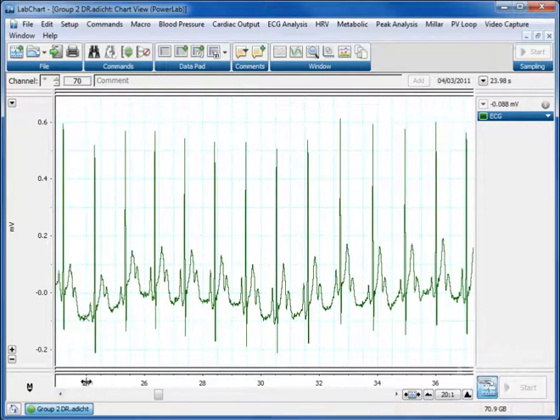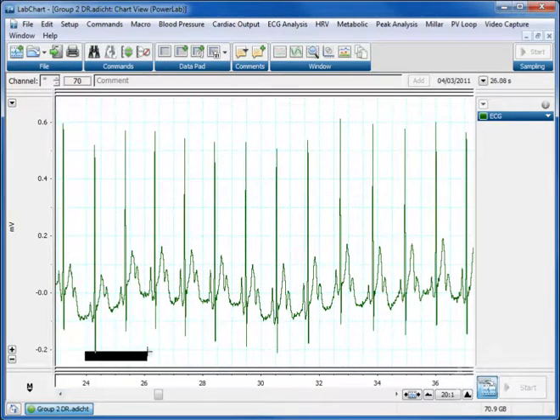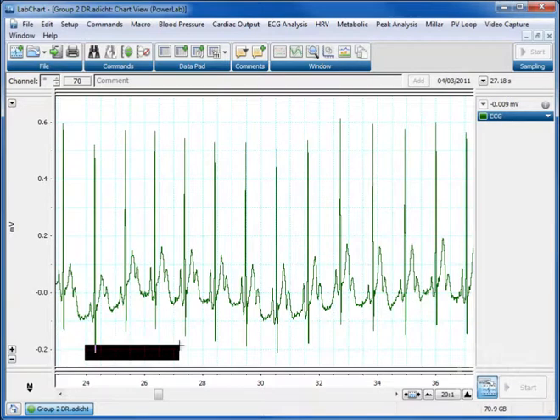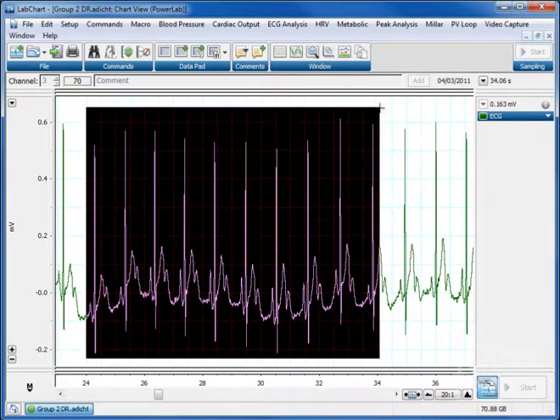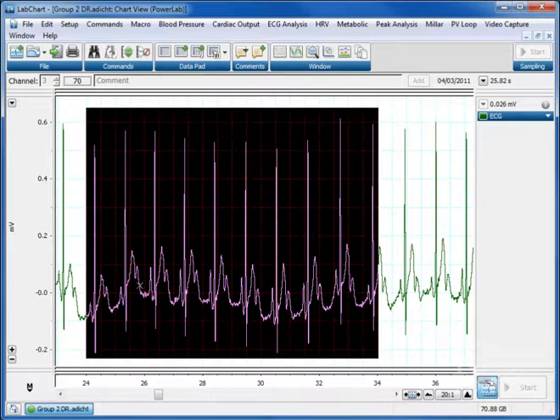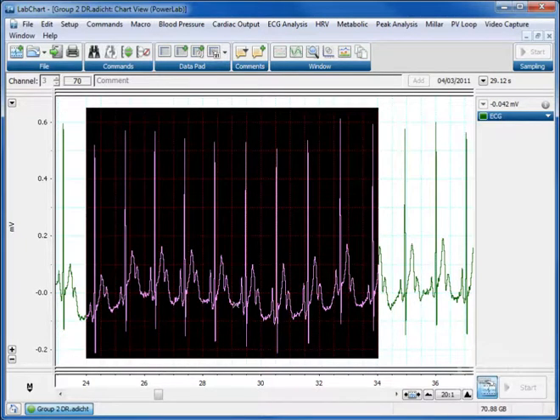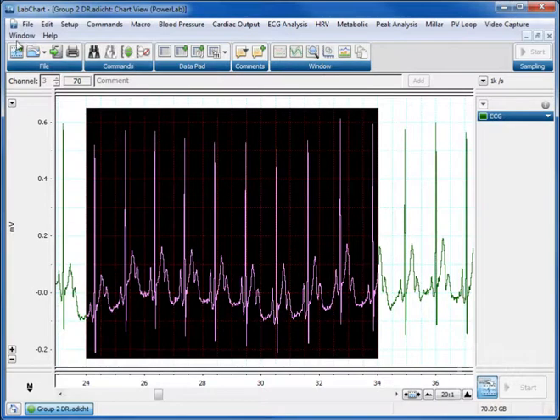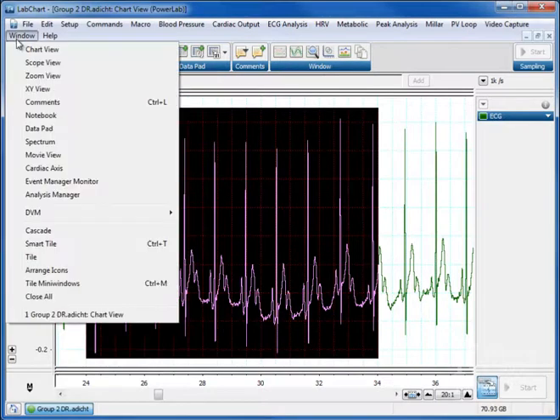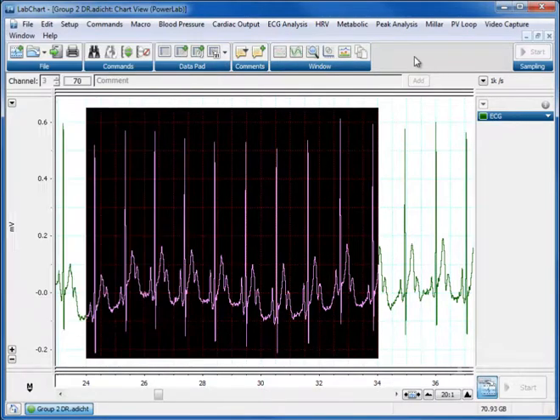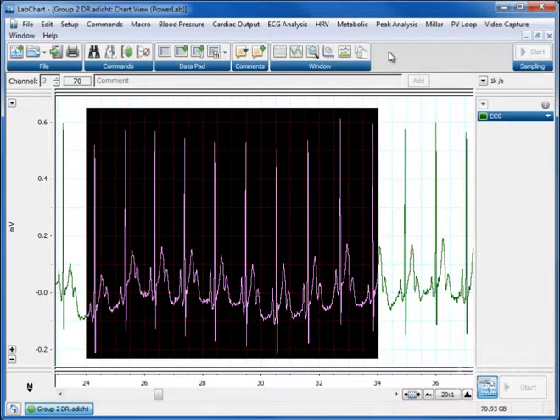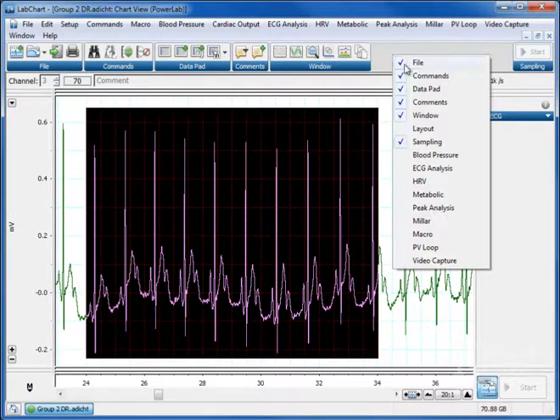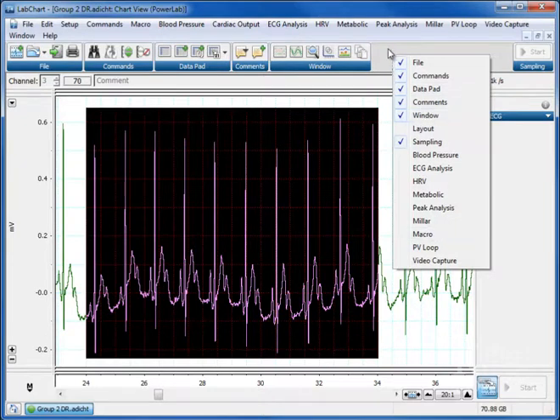To do that we can select in the window we're interested in, select all of the ECGs between 24 and 34 seconds into a big black box like this and then we go to the zoom window. The zoom window is under the windows menu where it says zoom view or it's up on the windows box in the menu bar. If you can't see this little box you can right click in the menu bar and make sure you can see the box window.